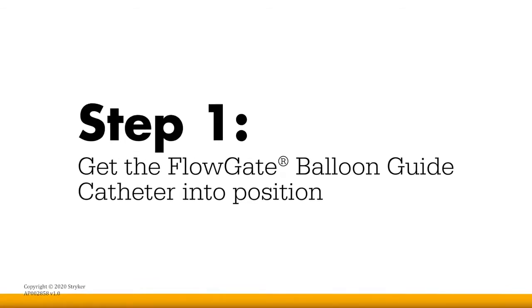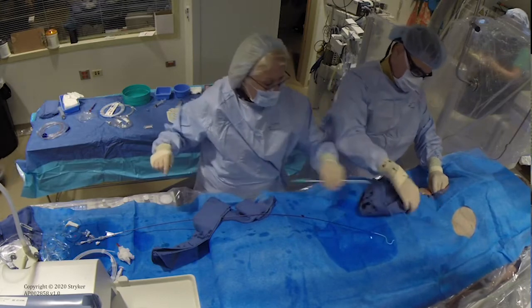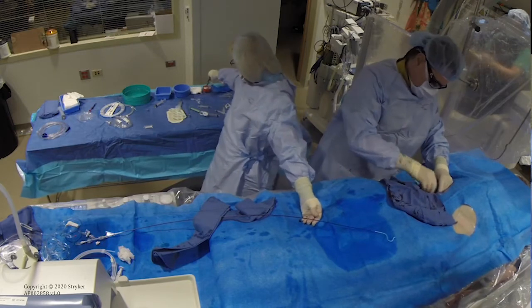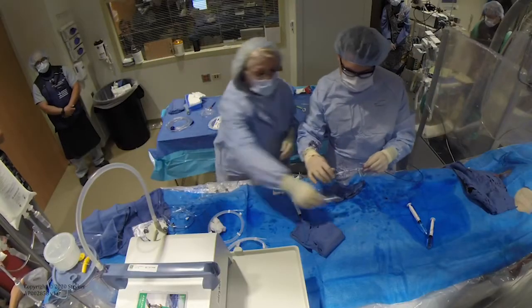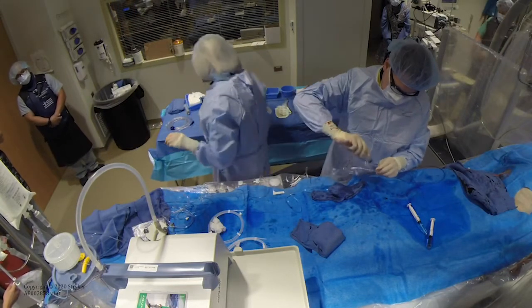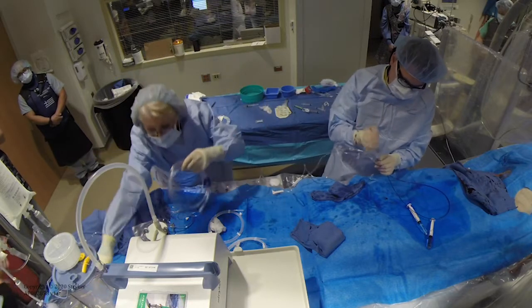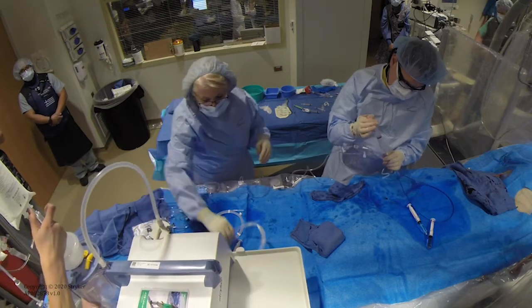In this case, we start by demonstrating the harmony you have to have with your team, and in this case we try to open all the devices in advance. You can see here that we have the FlowGate 2 set up, and the balloon is prepped, usually with half and half contrast, about 5 cc's.